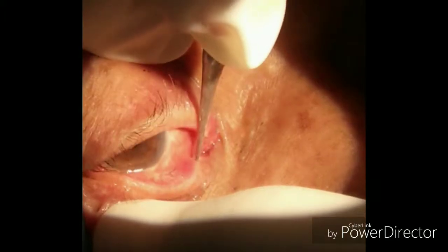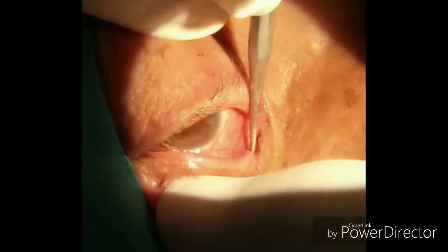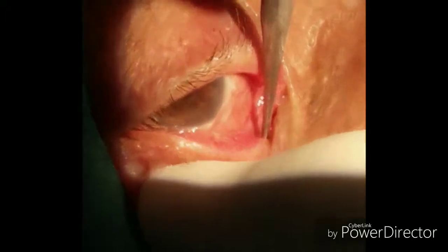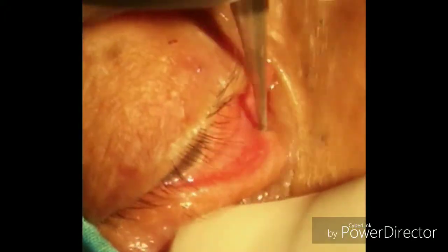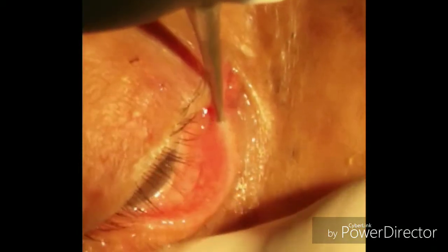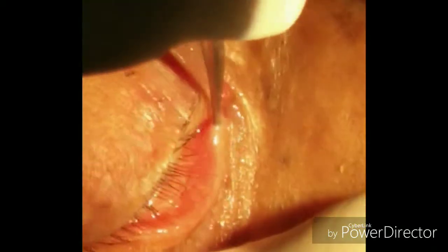Now you have to evert the lower lid so that the punctum is in the proper position. You can see the punctum, then with the punctum dilator you have to dilate the punctum — as we are dilating the inferior punctum here.